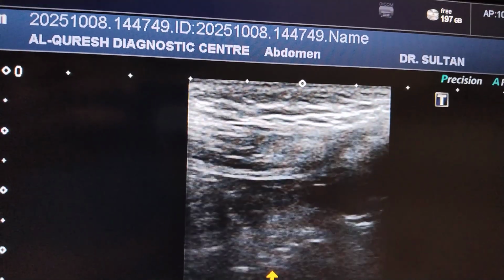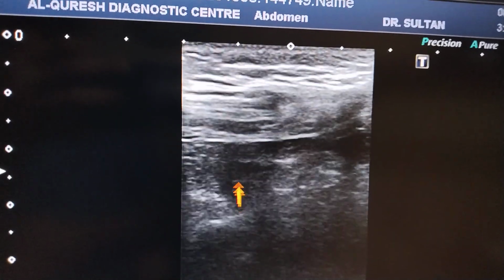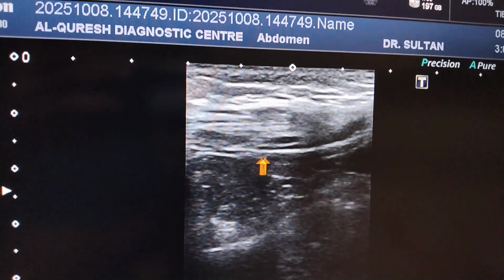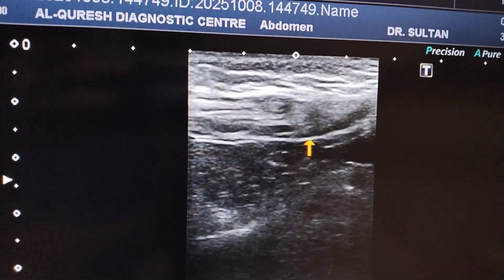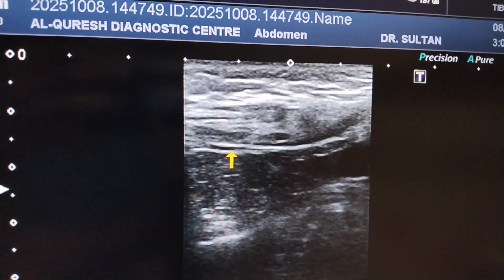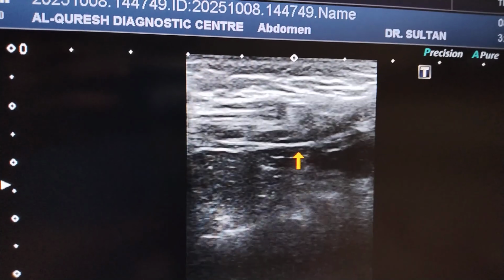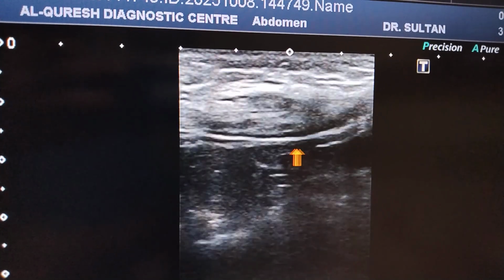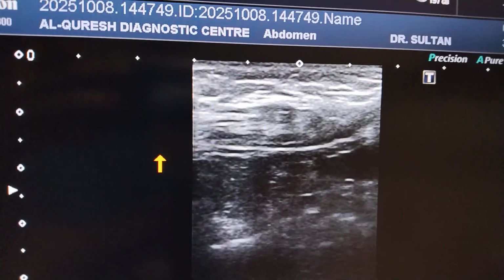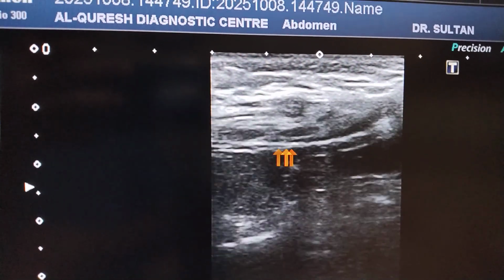This is the abdomen where the peristaltic bowel loops are present, and this is the anterior wall, this is the posterior wall of the inguinal canal, and at this medial aspect, this posterior wall is made up of fascia transversalis as well as the conjoined tendon, while on the lateral side at the level of deep inguinal ring, only the fascia transversalis is present here.